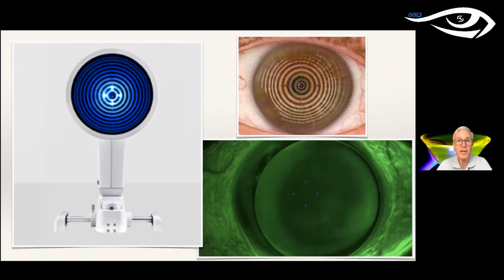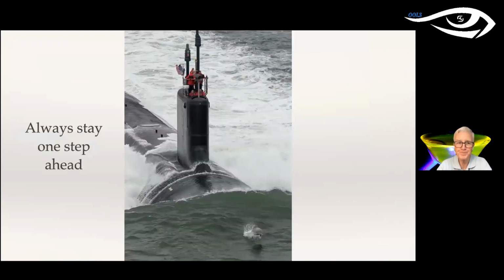However, they do have video capabilities. So you can look at how the lens moves at the blink and centers and so forth like that. Also good for tear breakup time. So some of these units, I think CSO, which is out of Italy, has a similar unit. Anyway, they're out there. So just keep in mind that some topographers actually have a camera built into them.